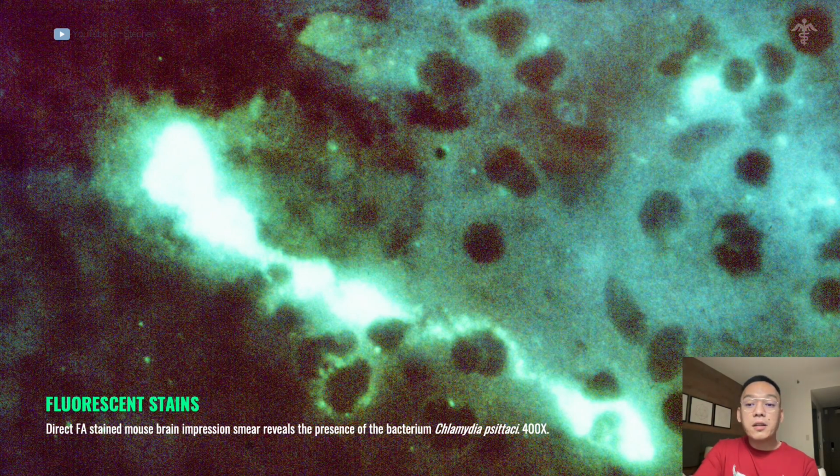The antibodies are complexed with fluorescent molecules, and specific binding to an organism is detected by the presence of microbial fluorescence. This technique has proved useful for the detection and identification of many organisms such as Streptococcus pyogenes, Bordetella, Francisella, Legionella, Chlamydia, Pneumocystis, Cryptosporidium, Giardia, influenza virus, and herpes simplex virus.